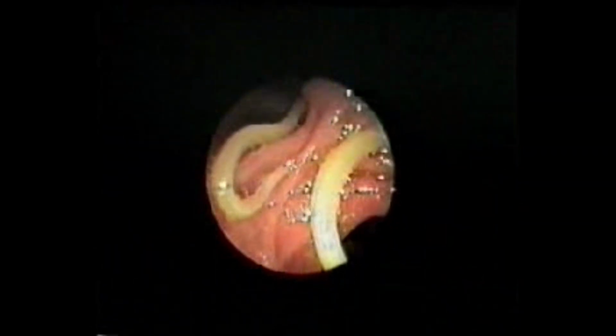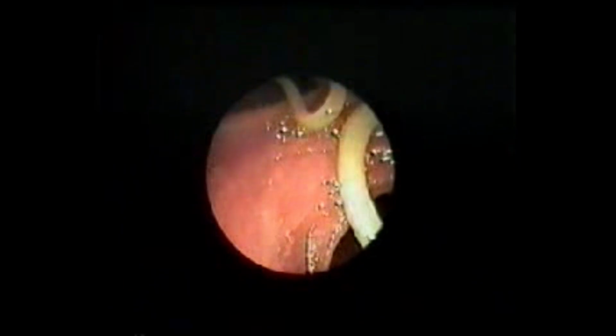One of the favorite orifices the worm explores and enters is the ampullary orifice, situated in the second part of the duodenum, causing the clinical disease entitled Hepatobiliary and pancreatic Ascariasis. The video shows a peculiar dance of the worm in the duodenum. With these dancing movements, the worm explores and enters the ampullary orifice, situated in the second part of the duodenum.